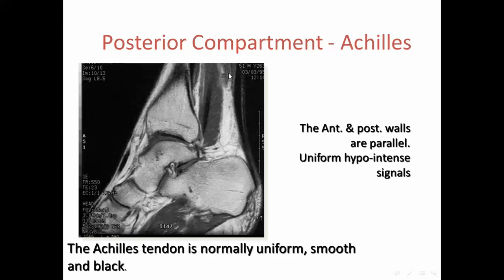It's normally uniform in thickness, smooth, and black. The anterior and posterior walls are parallel. No swelling, and it is uniformly hypointense.